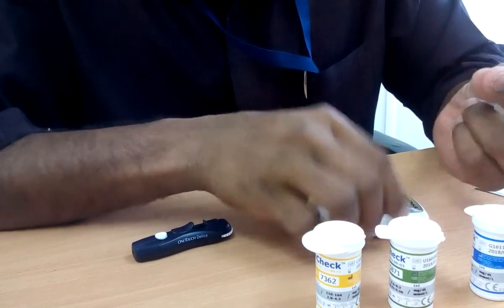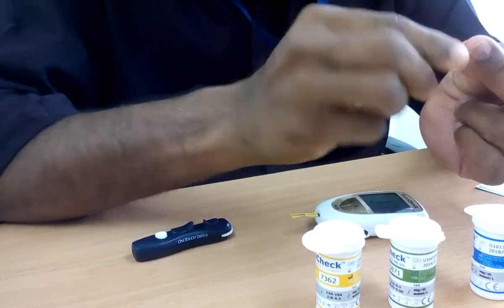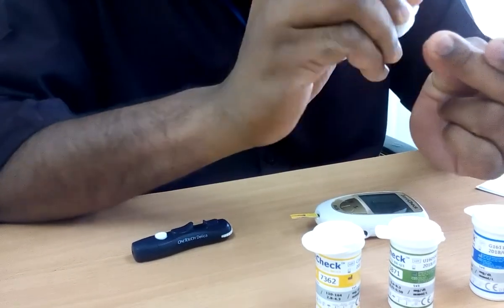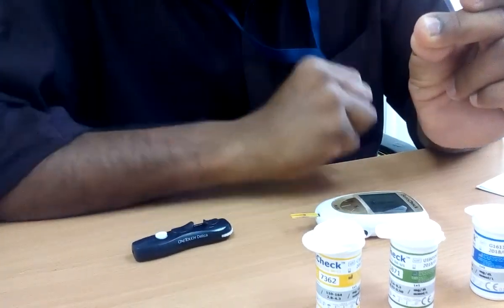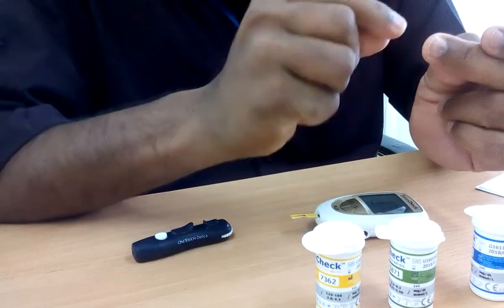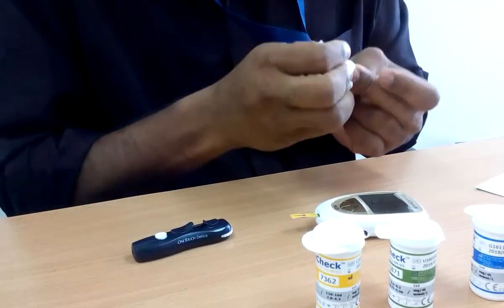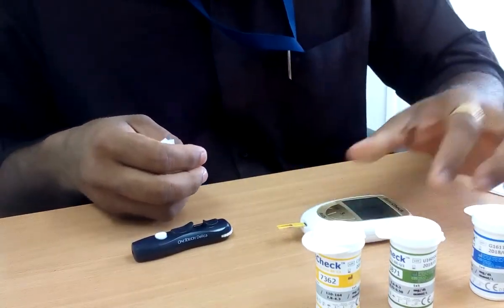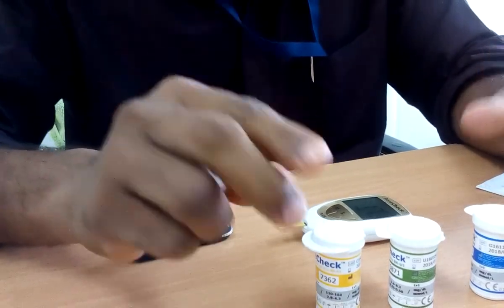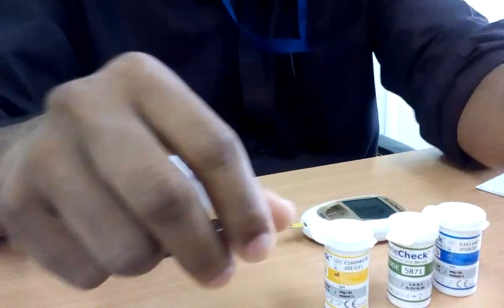Make sure that even if we use a spirit swab to clean the area, wipe it with something else afterward so that we get good blood. If there is sweat or spirit content, it can change the result. Anyway, thank you very much. This machine can give three test results — glucose, uric acid, and cholesterol. Thank you.